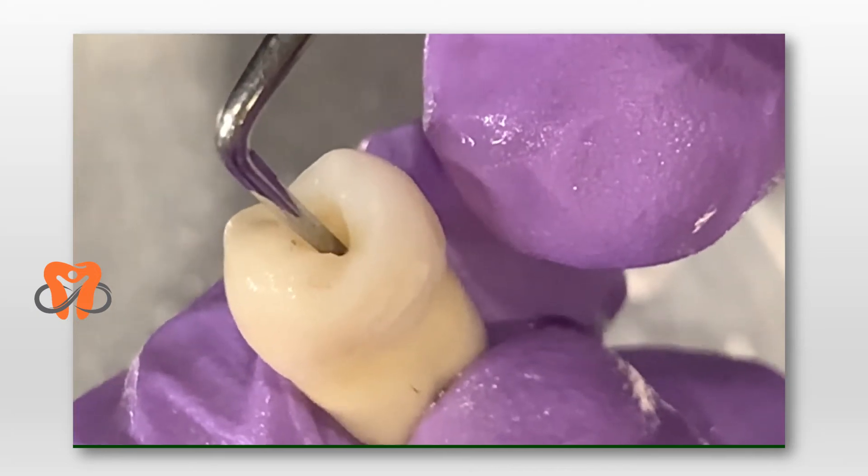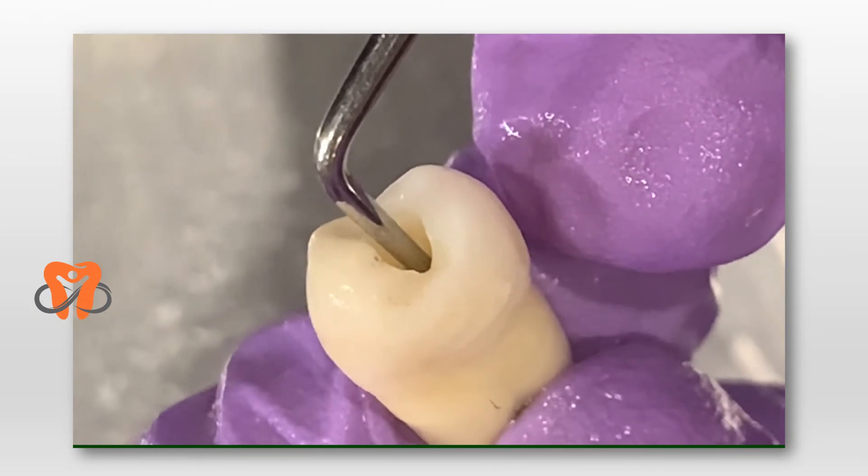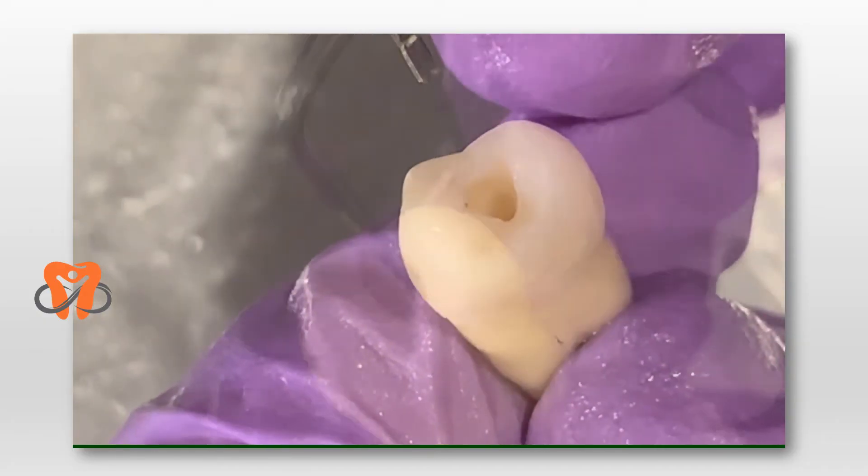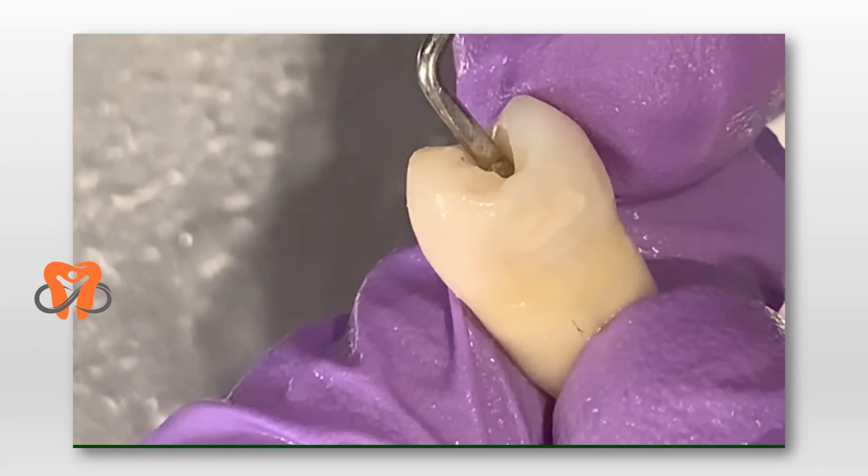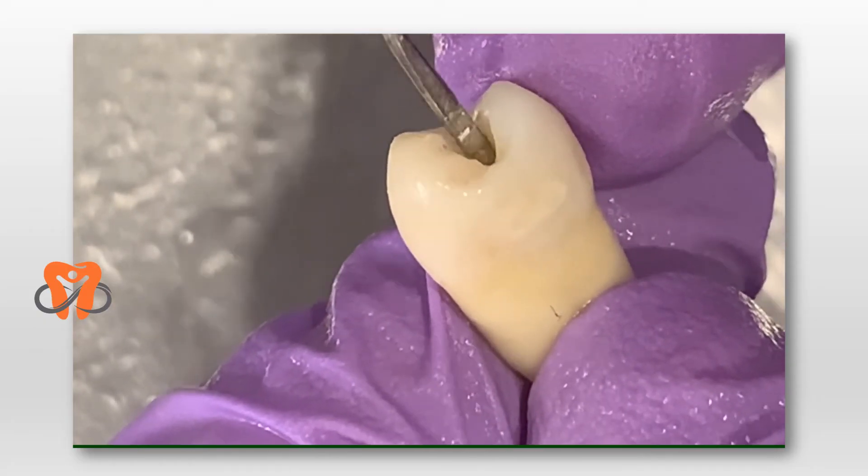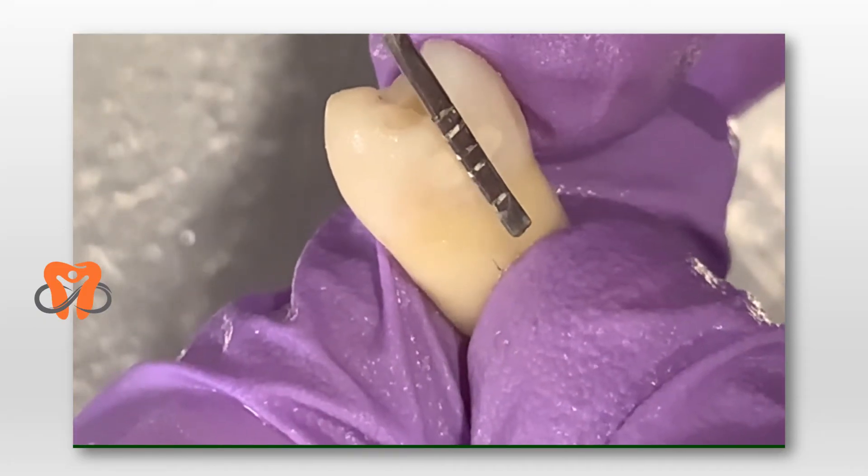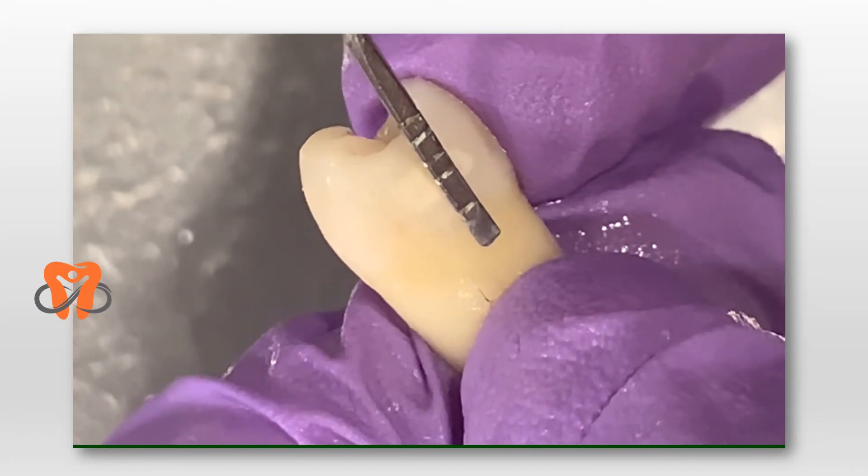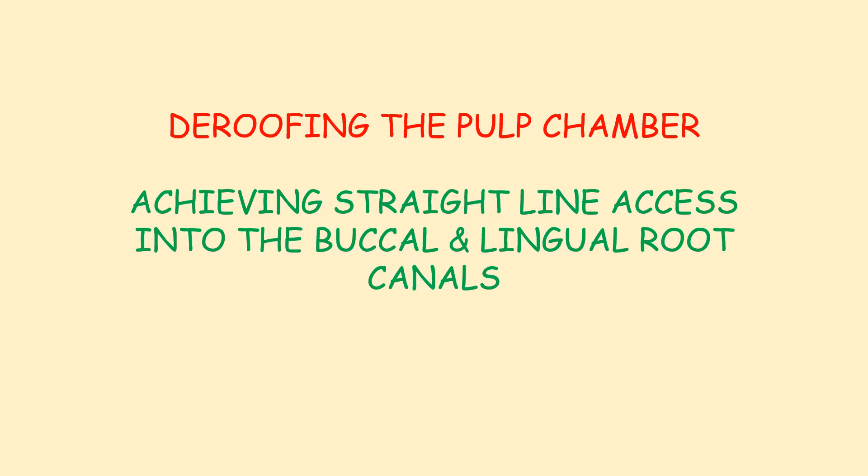With help of this endodontic explorer, we explore the pulp chamber. With help of a serrated probe, we note the depth of the pulp chamber. We take it out and place it against the tooth. You can observe that the location of your pulp chamber is roughly in the cervical one-third of the crown.